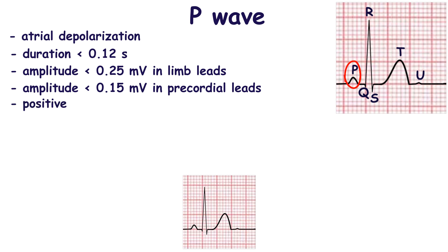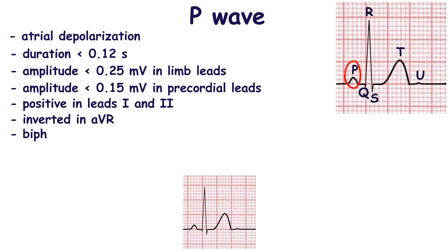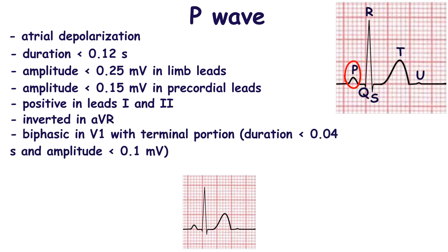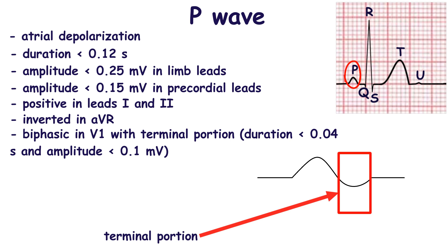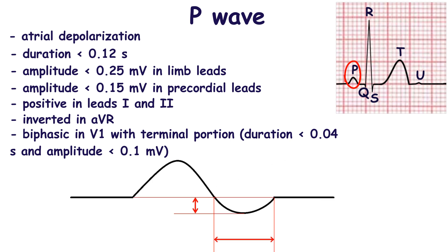The normal P wave is upright and monophasic in leads 1 and 2. It is inverted in lead AVR. Normally, the P wave is biphasic in lead V1, but its negative deflection is less than 0.1 mV.